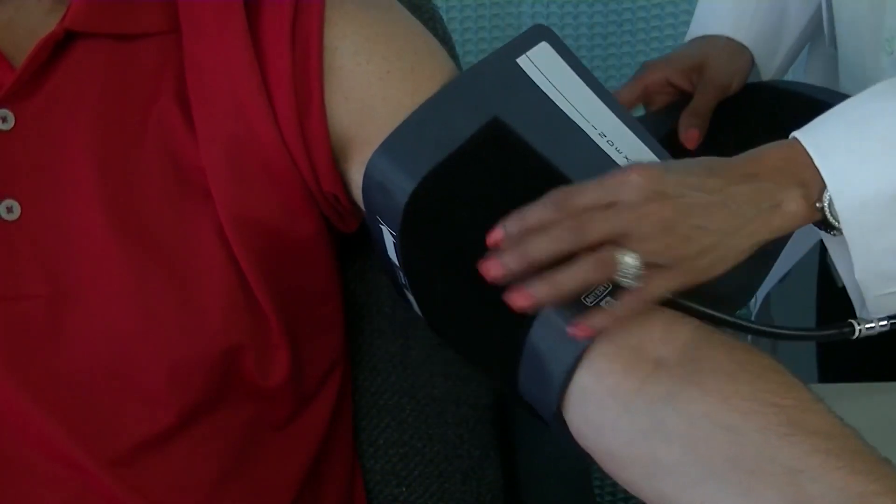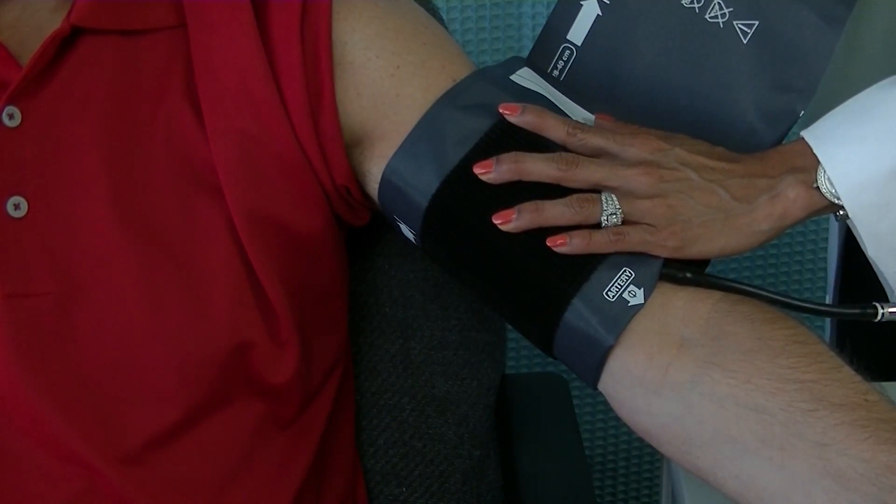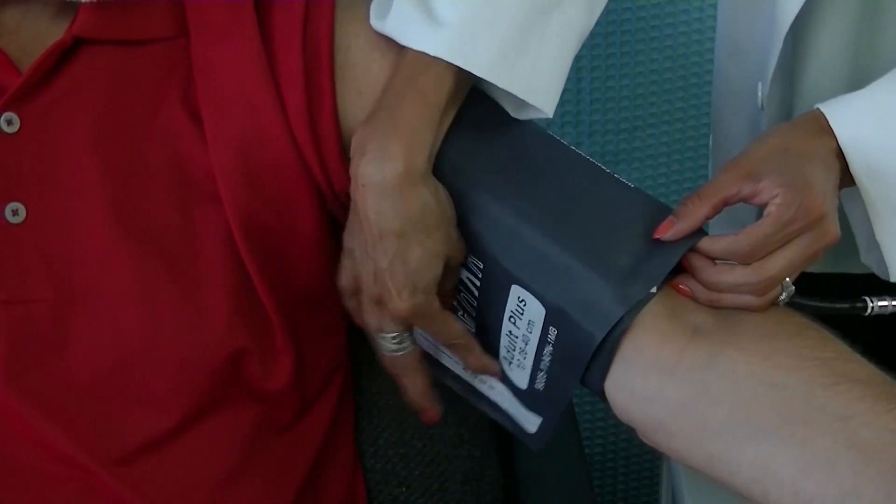Next, place the cuff around the arm. The cuff index line should fall within the printed range markers. If not, select a larger or smaller cuff to ensure an accurate reading. Make sure the arm is relaxed and supported, and ask the patient to stay still and quiet. Press the stop-start button to inflate the cuff automatically.